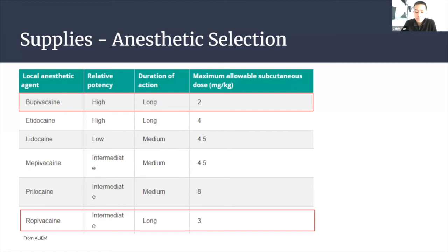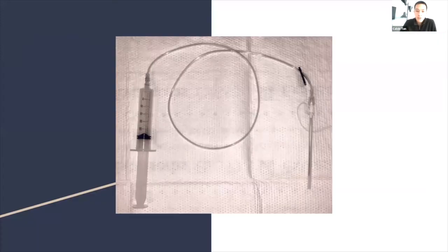All right. So this is what your final setup should look like. I forgot to list under the supplies, you need another person. Usually it helps so that one person can be holding the ultrasound probe and guiding the needle into place, and the other person can be controlling the syringe. So yes, bring a friend.